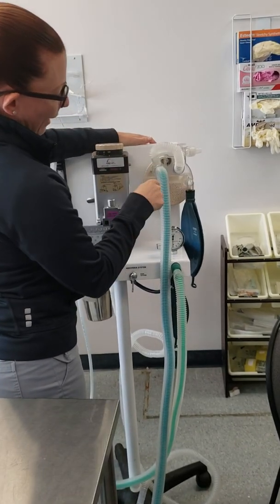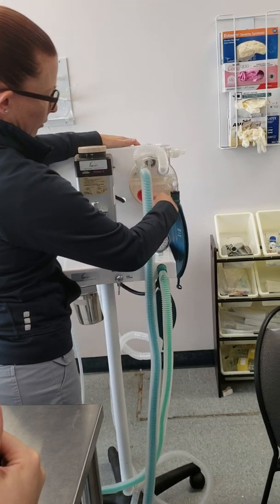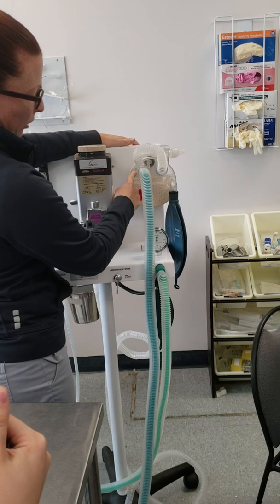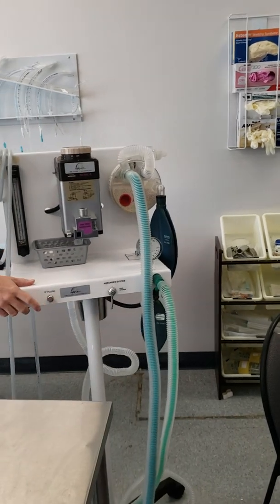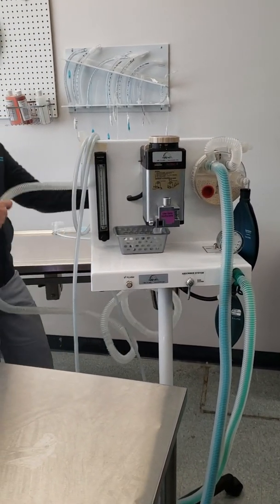So when my patient exhales, the air gets pushed through the soda lime canister and is either recirculated in through my inspiration flutter valve here, or a portion of it goes into the bag, or a portion of it goes out the scavenge, which is hooked up on the other end of my scavenge tube.